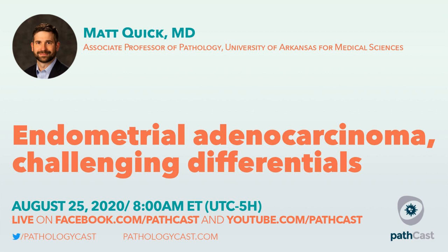In other words, if your mucinous proliferation is demarcated, so cytologic demarcation, if that proliferation is about 1 millimeter in size, and if the background endometrium looks different, again, cytologic demarcation, I would tend to favor a diagnosis of a mucinous EIN or atypical hyperplasia in a case like that.